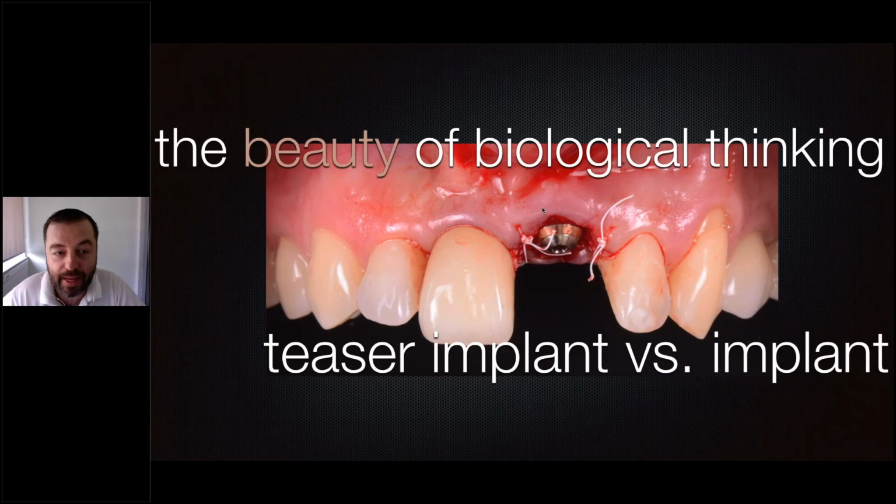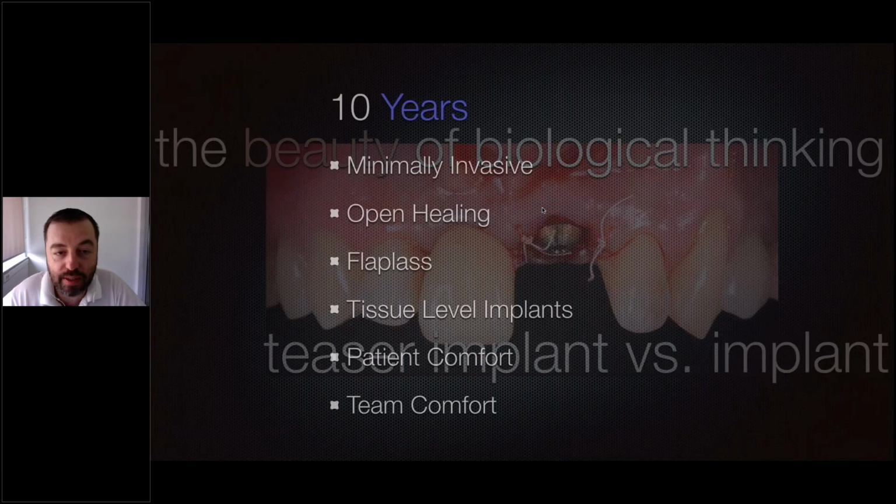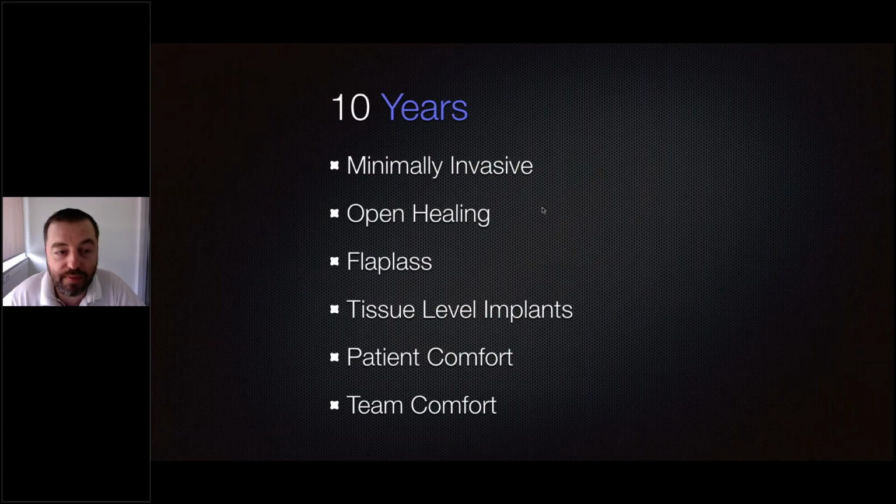So it will be very interesting to see in a few months the final outcome for that. And now, after 10 years, I go again through our, let's say, keywords: minimal invasive, open healing, flapless, the tissue level implants, and of course, the patient comfort. When the patient has comfort, the team also has comfort. We don't need to answer our mobile phone during the night, because nobody is going to swallow or have big problems with this type of surgeries.